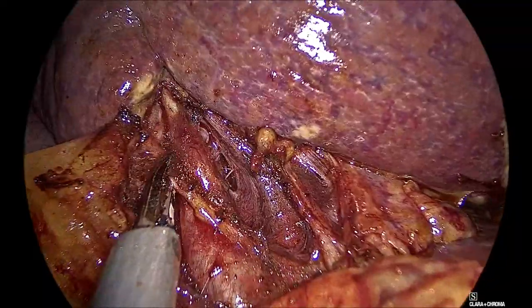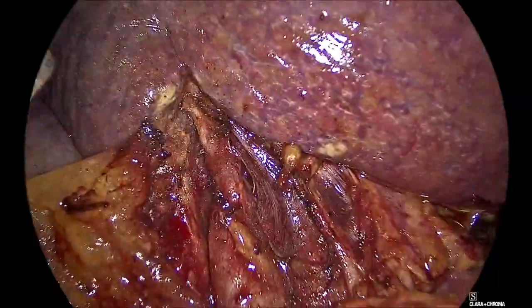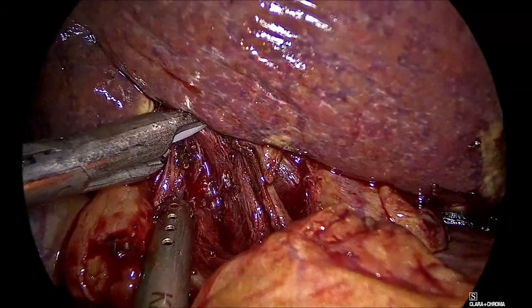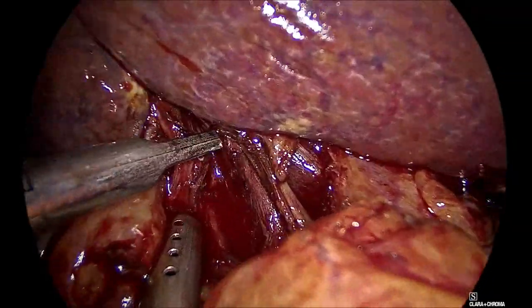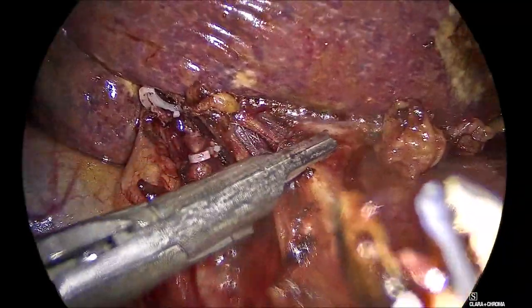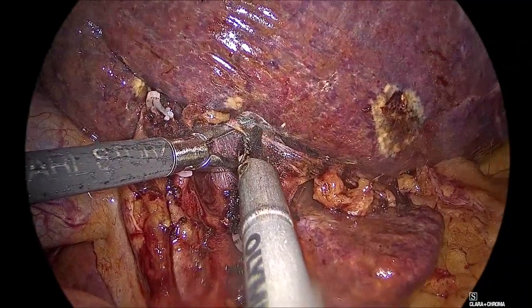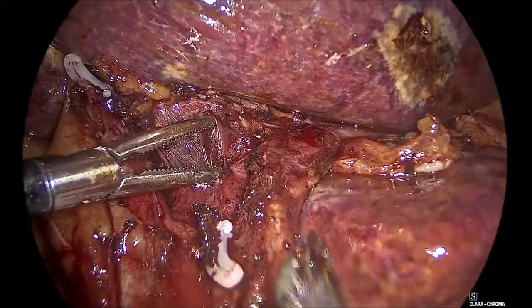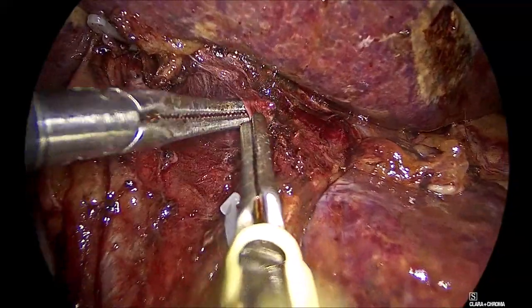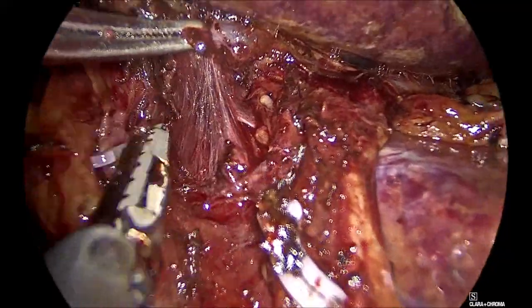Dissection was carried on to the umbilical plate level. The middle hepatic artery was dissected — it was branching from the right hepatic artery — and once it was looped, it was divided after applying a Hem-o-lok clip. A small twig going into segment 2 or 3 was also divided. Significant fibrosis made dissection quite challenging, as a vein can be mistaken for fibrous tissue. We spent nearly an hour to loop the left portal vein.